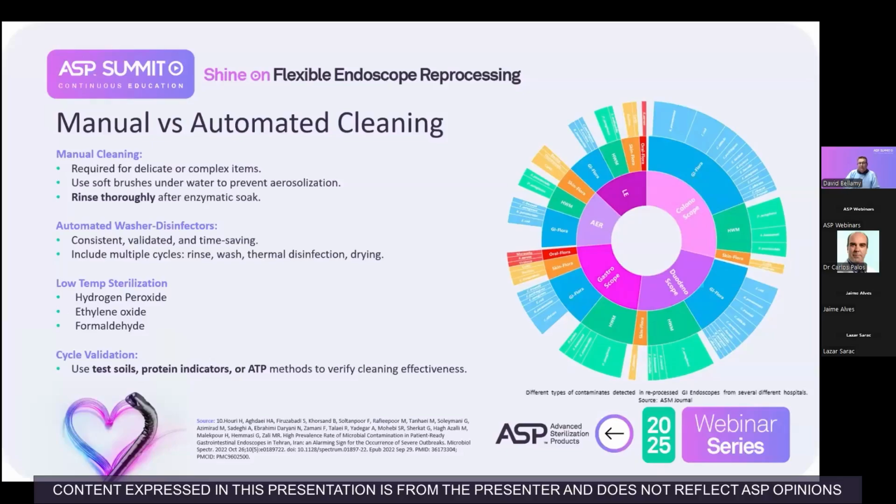However, with the advancements of technology, more manufacturers are now validating devices for alternative low-temperature sterilisation methods, such as hydrogen peroxide plasma. And this is allowing for a faster turnaround, less toxicity, and importantly, having it available in a shorter time frame. Also, with a sterile cycle, manufacturers of washer disinfectors are introducing advanced cycles. They're claiming sterility, reaching a sterility assurance level of 10 to the power of -6, which is aligned with the standard benchmark for sterilisation and a log 6 reduction in microbial load.